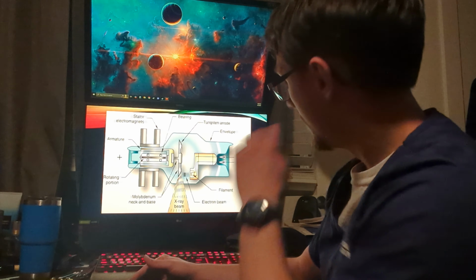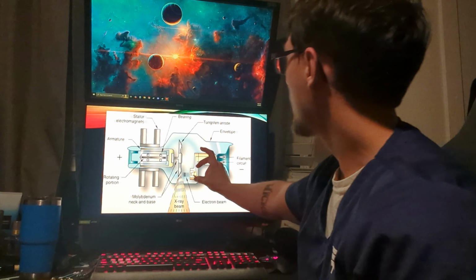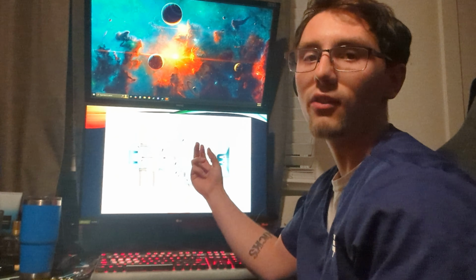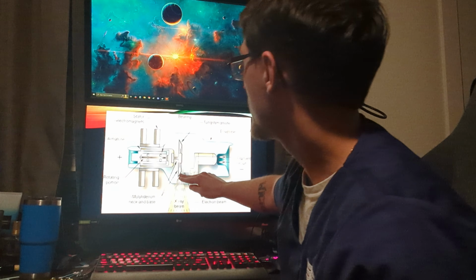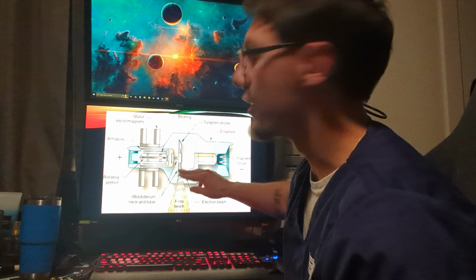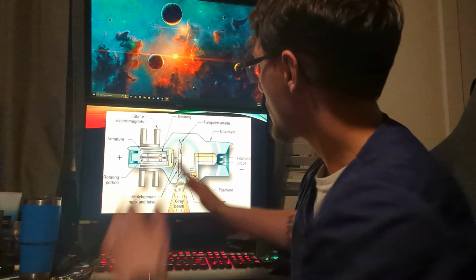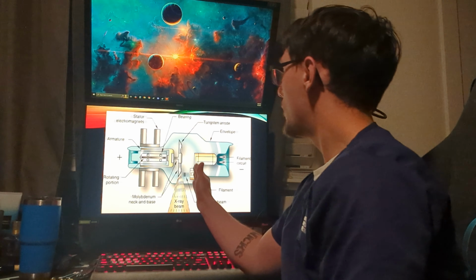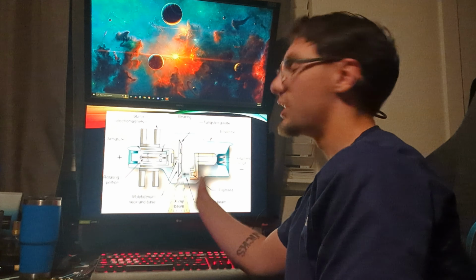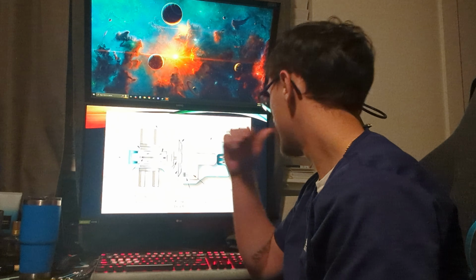Okay, so sorry, we had the electrons thermionically emitting, and the cloud is produced. Once that entire cloud reaches the amount of electrons needed, it will be sent over to the rapidly rotating tungsten anode, and it'll reflect off of the tungsten anode, bounce off of it and come out the window, and that'll become your actual X-ray beams. Once all of the electrons that were sitting on the filament here are sent to the anode, that will be saturation current, when there are no more electrons to be sent towards the anode.